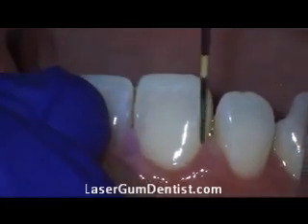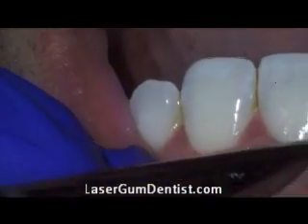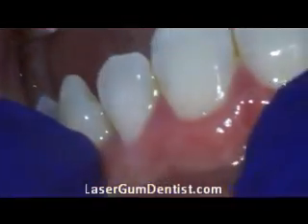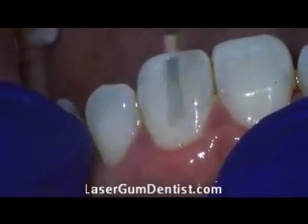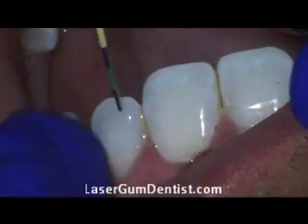Again, different teeth — we're placing that instrument down. The advantage of doing the LANAP procedure as opposed to traditional regenerative procedures like guided tissue regeneration, also known as GTR, is that no foreign products were placed into the pocket. Nothing else was added in there other than laser energy and cleaning the root.